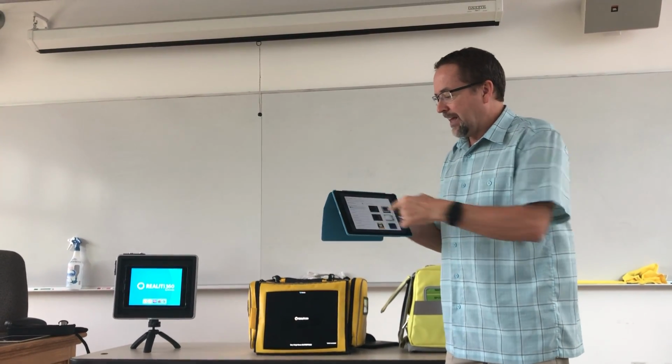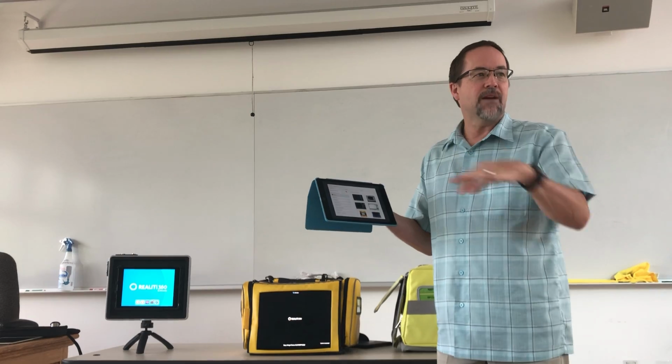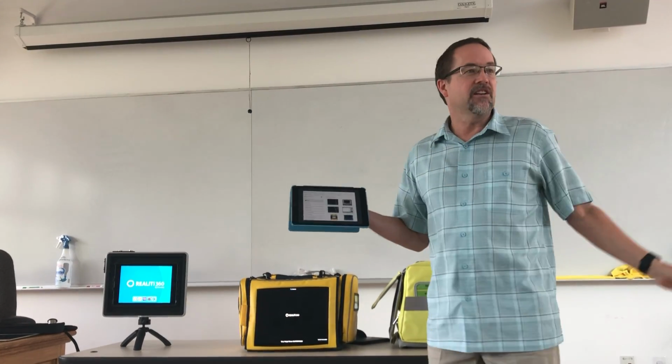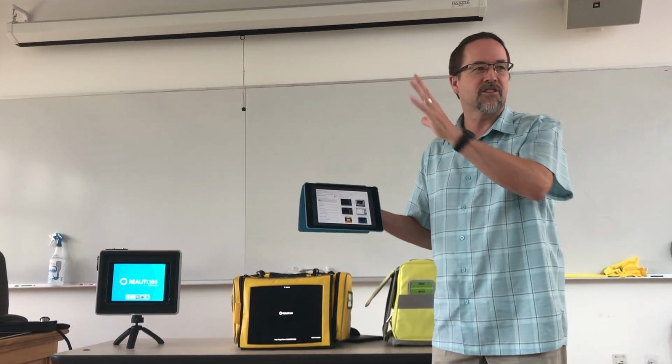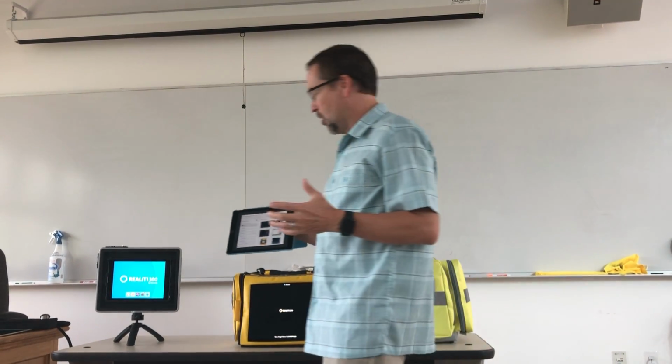When you get it, it will probably come loaded with a bunch of their demo scenarios. I would suggest deleting all that off of there because it's intended to show you all the different monitors it can go through, and it actually gets more confusing than it is helpful sometimes.